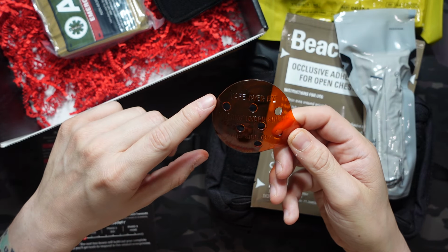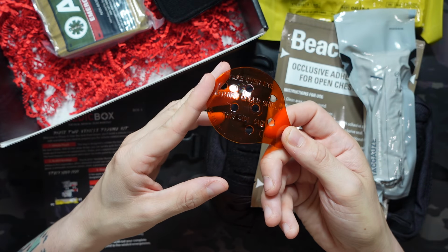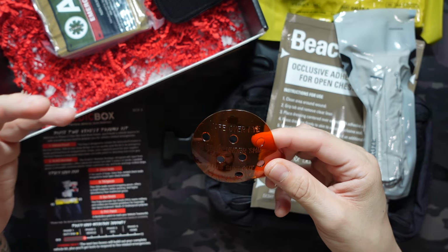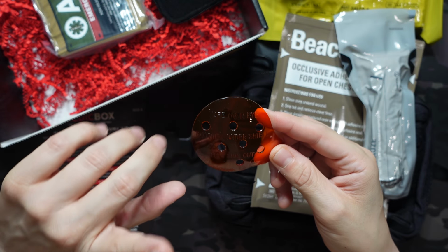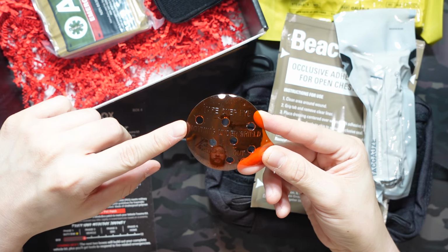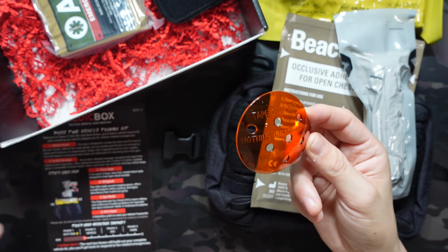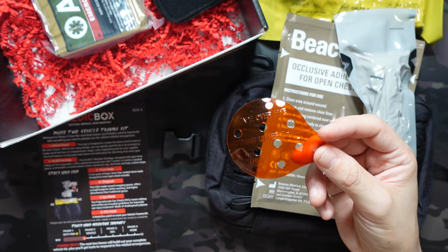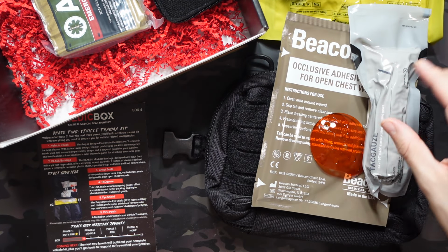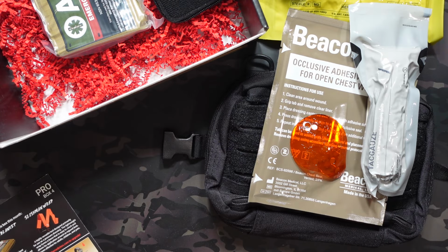So tape over eye, nothing under the shield, this side out, and there's some venting holes there as well with a patent number, just kind of a tinted eye shield here that, again, it's going to be covered in tape anyway, so that tint's not as important, but polycarbonate eye shield meets military and civilian pre-hospital guidelines for traumatic eye injury treatment, made of shatterproof polymer. So this is a cool item for sure, and again, an item that may be very helpful in a roadside type accident.